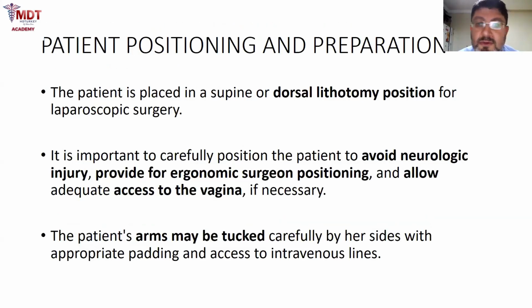Of course, we do the surgery in the dorsal lithotomy position. For laparoscopic surgery, you have to be careful to avoid neurologic injury in this position, and you have to provide an ergonomic surgeon positioning. This position also allows adequate access to the vagina if necessary.